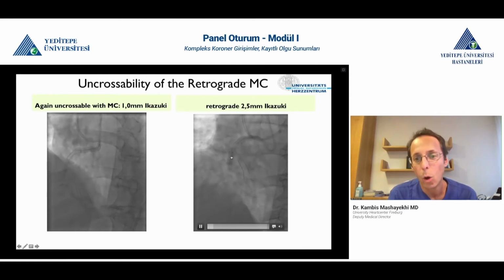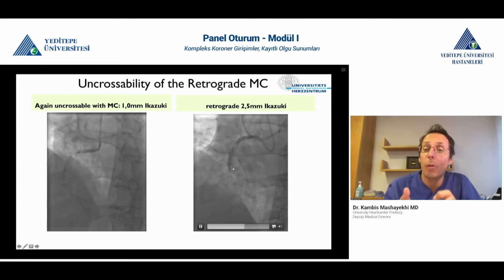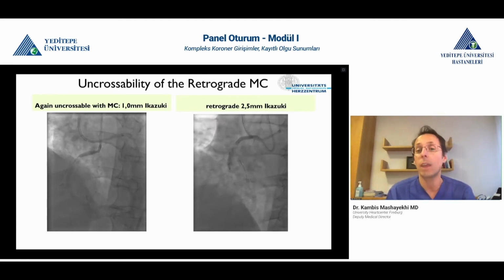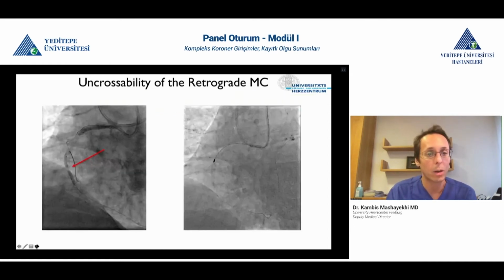So it's also retrograde balloon and antegrade balloon. So I dilated again retrograde. But you have to be aware, if you have a perforation there, you can't cover it. So therefore, not too high pressure, but just to create some space for the retrograde microcatheter.